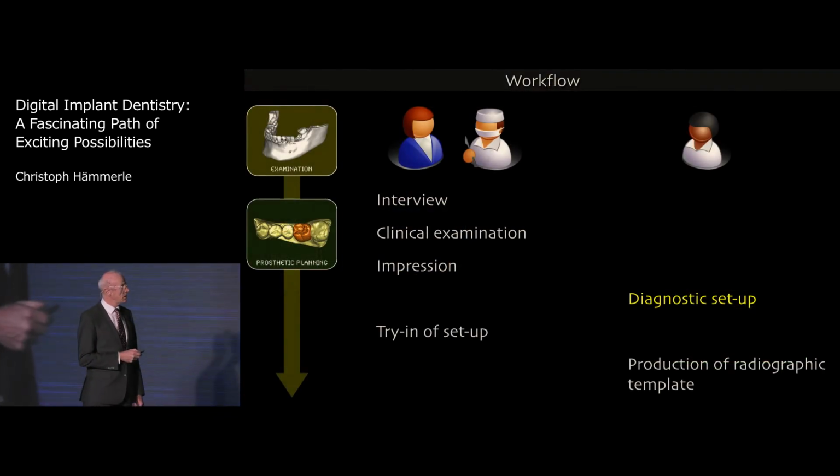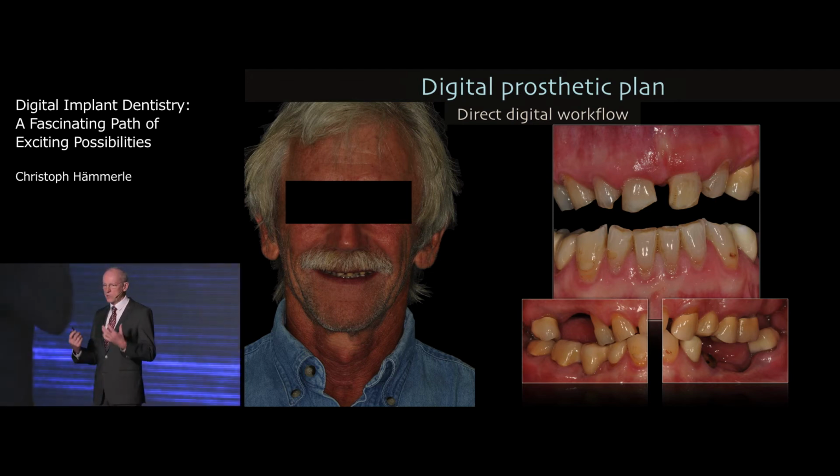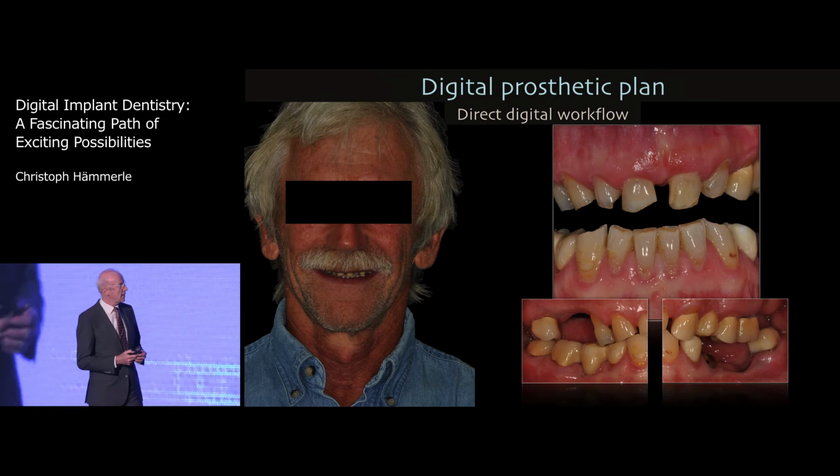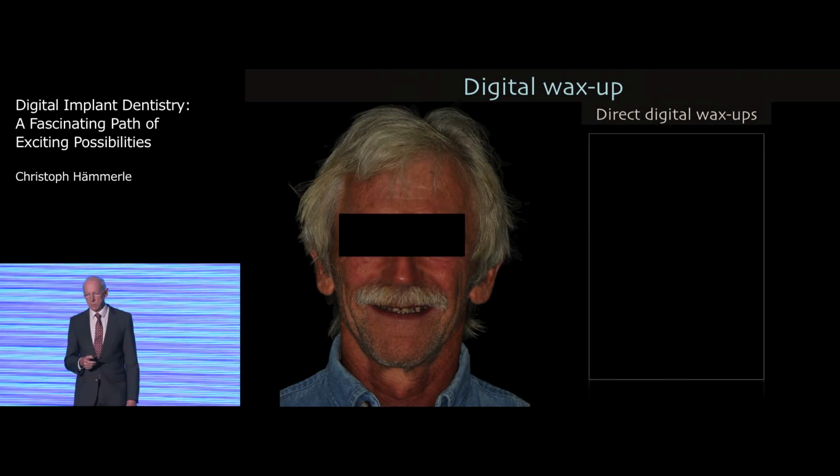When you have some routine, they're easy to work with. Then we do a diagnostic setup, and let's look at a patient. I know it's a pretty complex situation, it's not an everyday case, but we need to make a treatment plan and mimic together with the patient the final outcome we're looking for as the end of treatment.